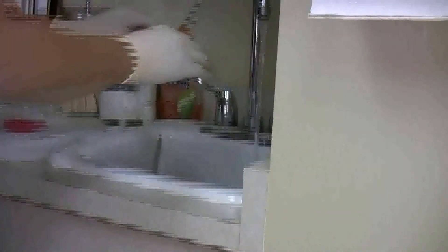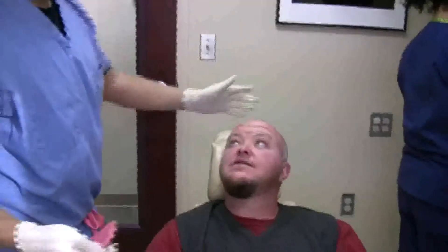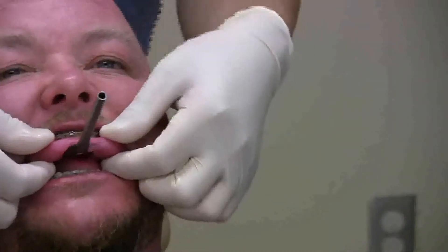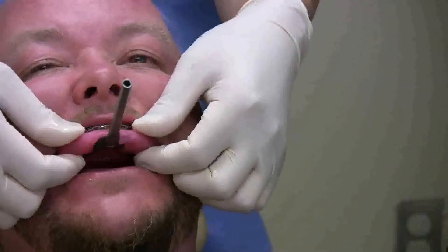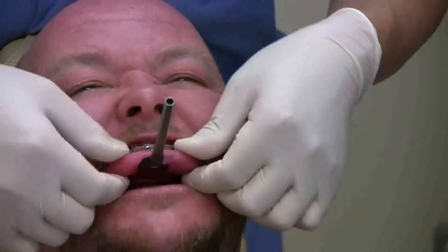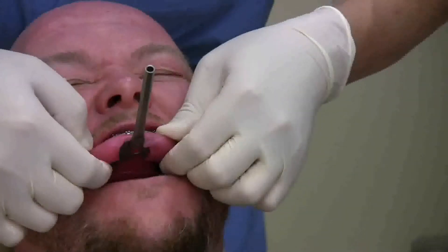So do you do all the modeling by hand or do you have a machine? No, I do it all by hand. There's a new wave coming out that we use in the computer, but I don't think it's as accurate. The models that they produce aren't as accurate, and it's very costly to be patient. For what you gain out of it, it's not perfect yet. So I won't do that yet.